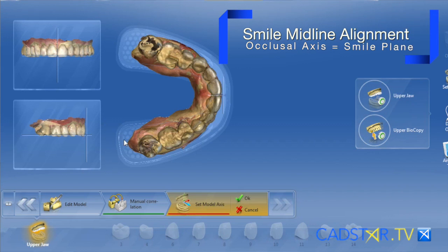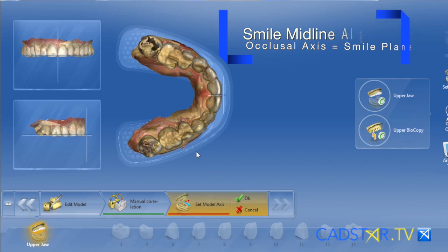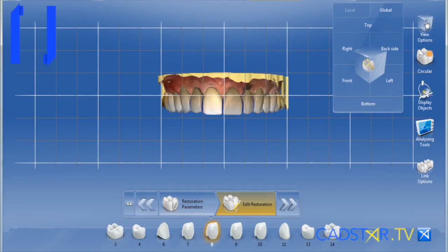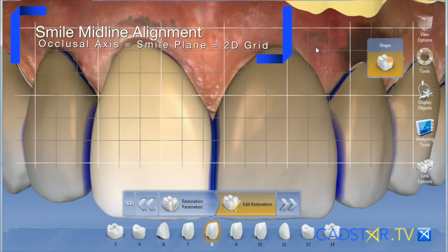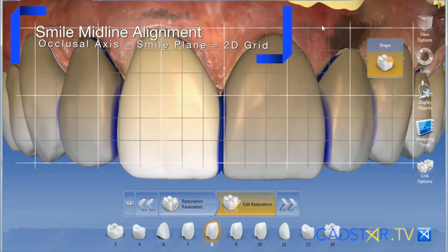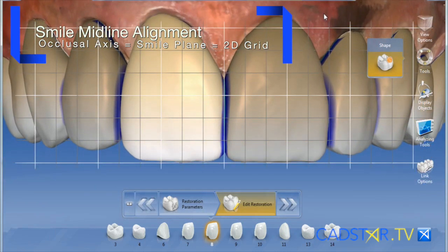With our current software, I am finding that there are two things in this software that's been updated that really help me out. The first is the model axis, because you're going to set your model axis up to your smile plane. Number two is the 2D grid — using your view options on your side panel will allow you to set your model up to the smile plane.